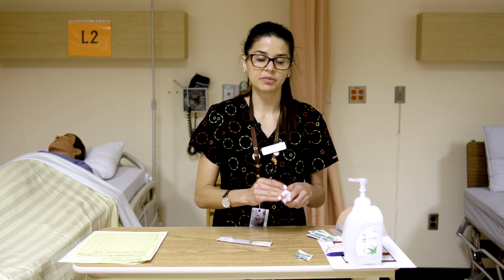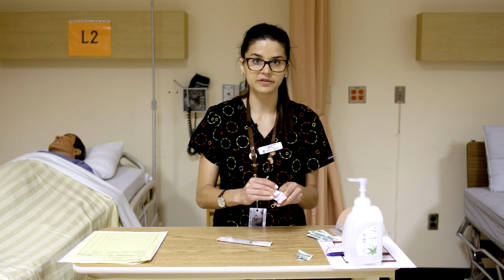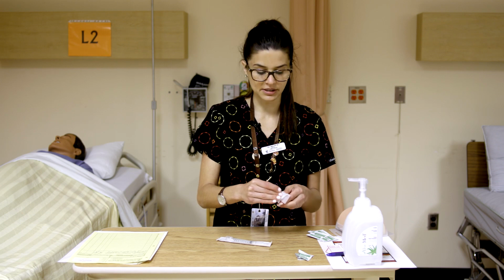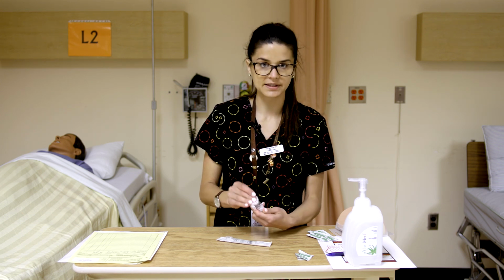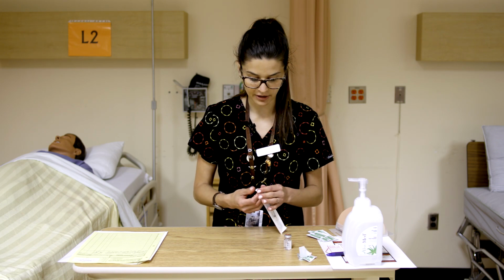And just like we mentioned before, because it's a pre-attached needle, we will not be using a blunt fill in this case. But had it not been a pre-attached needle, this is a situation where we would want to use a blunt fill. Not a blunt fill filter, because this isn't an ampule, but a blunt fill. So we're going to prepare our syringe now.